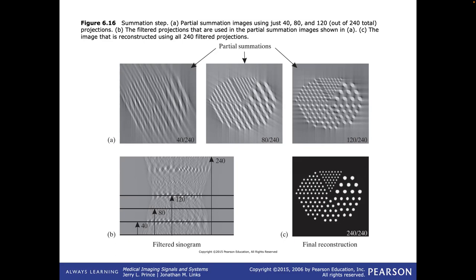What we've done is we've figured out, just using calculus, that we have to use the Jacobian if our data is in polar coordinates in the Fourier space in order to do the inverse Fourier transform. We do it in polar coordinates. There's a Jacobian in there that is K, the absolute value of K. And that K makes all the difference, because when you do that inverse Fourier transform, you actually get the original object back. So that's how you do the reconstruction. That's called convolution back projection, and that's been done for like 40 years.